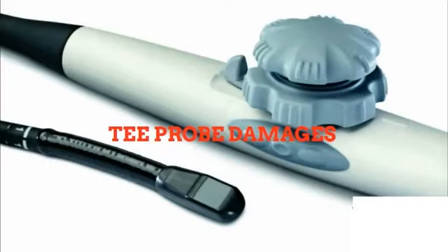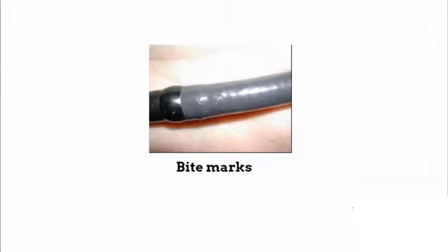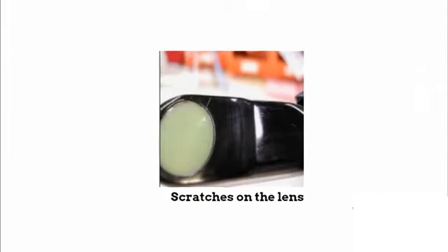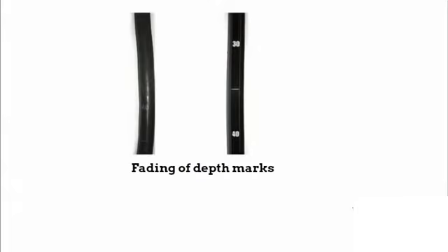T-probe damages include: contaminated bending rubber, bite marks, scratches on the lens, broken seal near the head of the probe, and fading of depth marks.